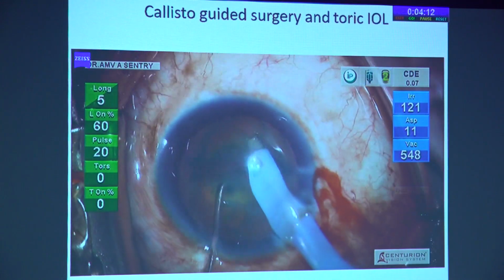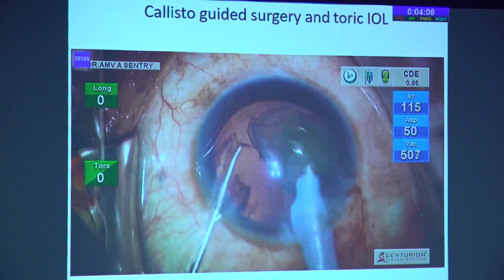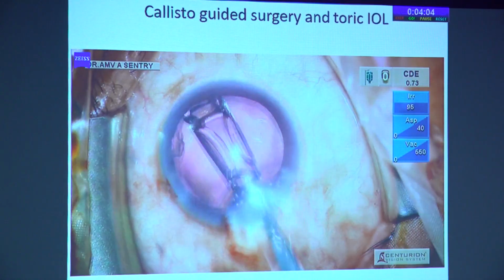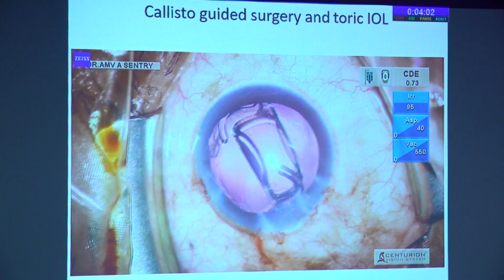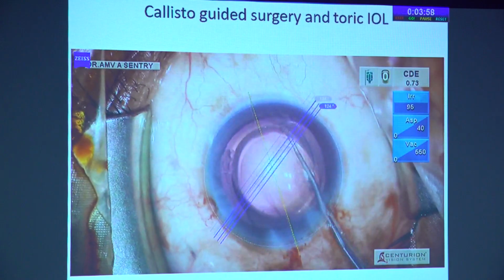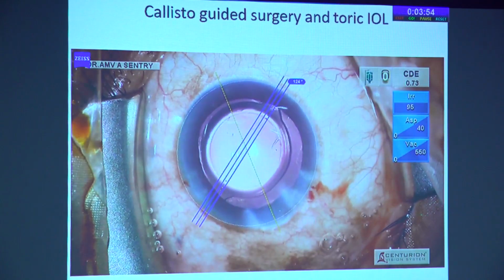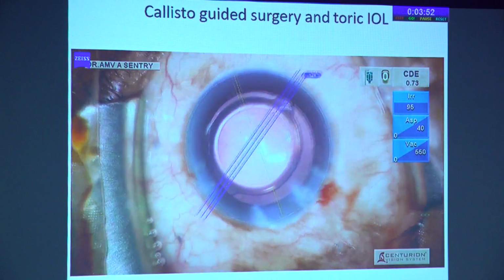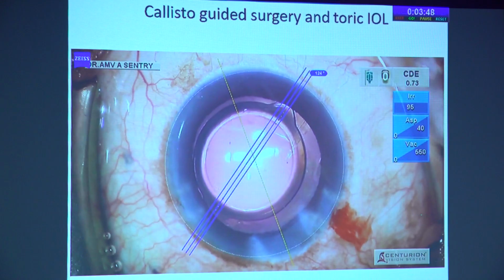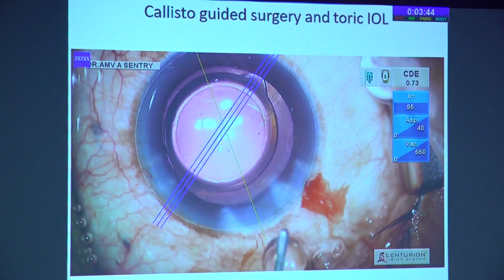This is a routine phaco. So after the nucleus fragmentation and emulsification is done, it's now time for us to implant the IOL. So you implant the IOL into the bag, and then you wait for the Callisto to turn on, and then you can align it along the correct axis. You just have to align the toric marks along that blue line, the central blue line, which is now the 124 degree axis. I can see here it's very easy for you to get that alignment done. And this alignment is quite precise. You can be spot on that this is at the 124 degree axis.